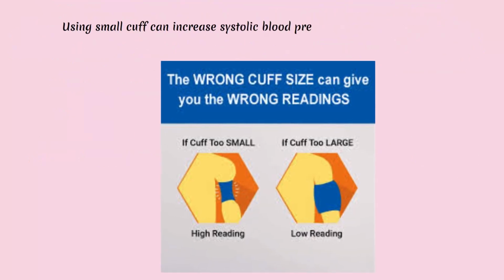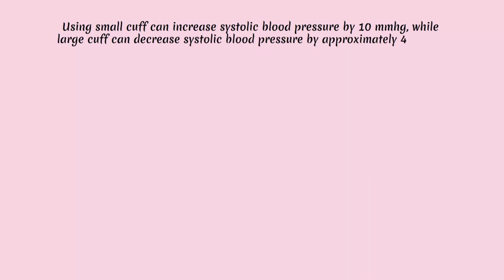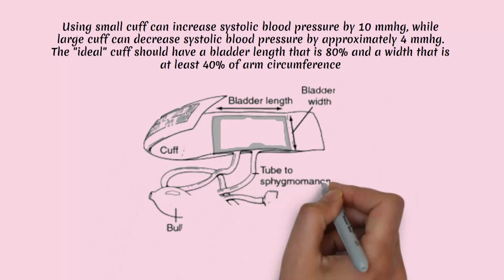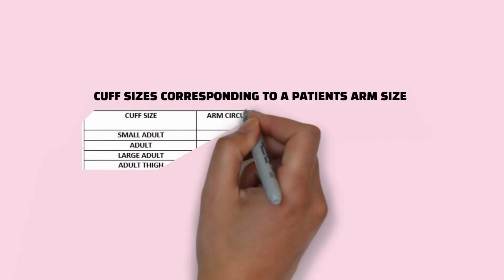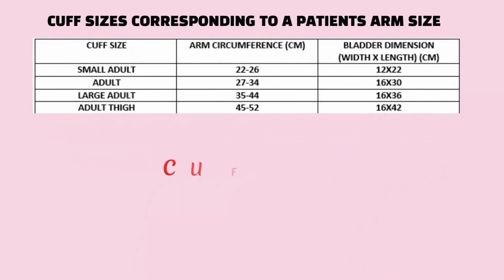Using a small cuff can increase systolic blood pressure by 10 mmHg, while a large cuff can decrease systolic blood pressure by approximately 4 mmHg. The ideal cuff should have a bladder length that is 80% and a width that is at least 40% of arm circumference. Here on screen, you can see the different cuff sizes according to arm circumference. Now we will see the technique of cuff placement.